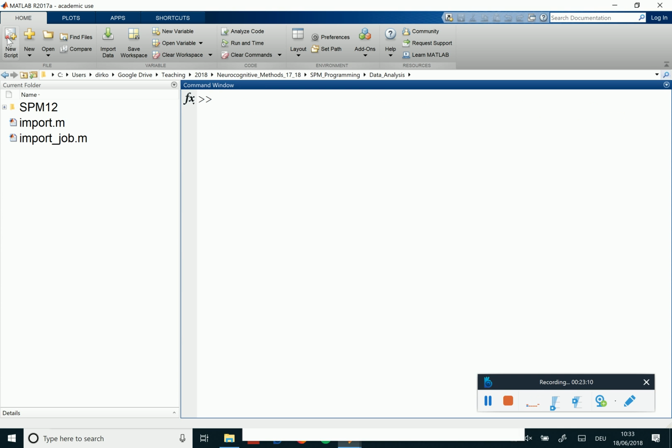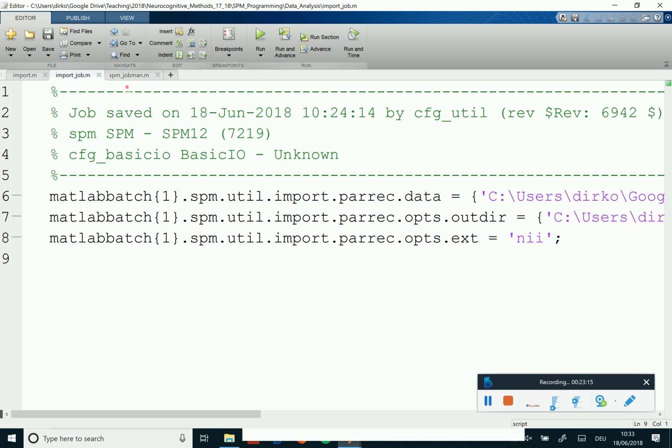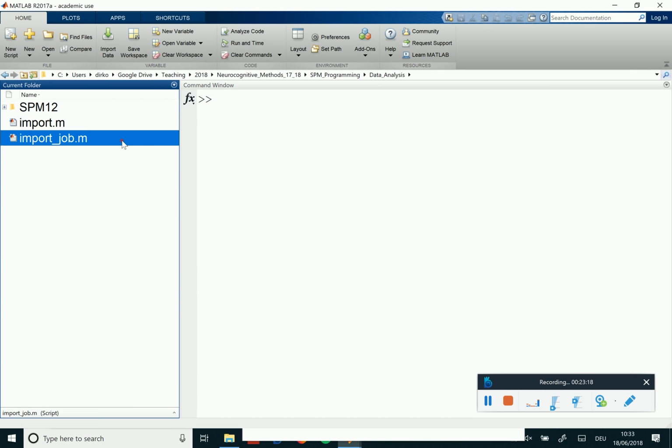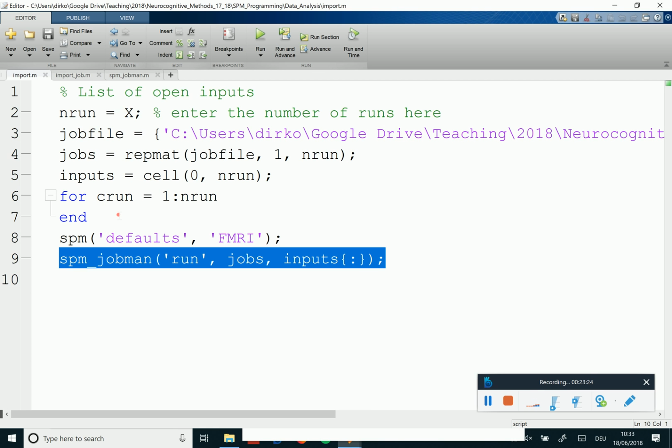Good. So the aim now is to actually write this import into a script, and we have what we need for it. We know how to call it. We also have old scripts that were created in the same way, because I shared them with you. Based on this, we now write a script for fMRI preprocessing, which in its first step imports the data. And all the other things we do in preprocessing, splitting the NIfTI file up, realigning, smoothing, we do once we've scripted this.